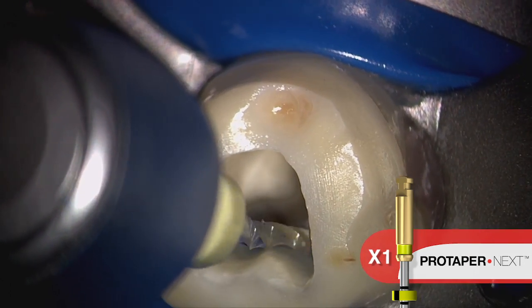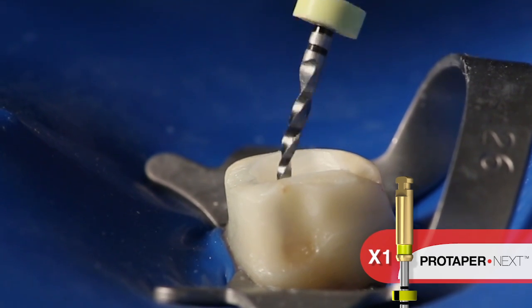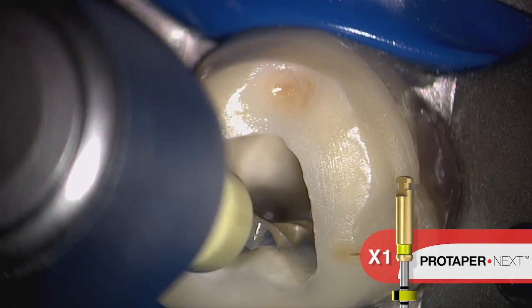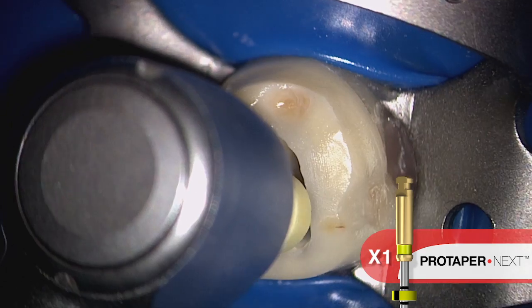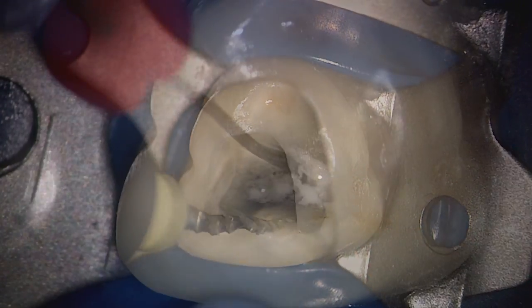In one or more passes, continue with the X1 file using this brushing motion. This specific action allows the file to work into the eccentricities off the rounder parts of canals. Brushing allows us to create lateral space, which promotes the instrument's inward movement.